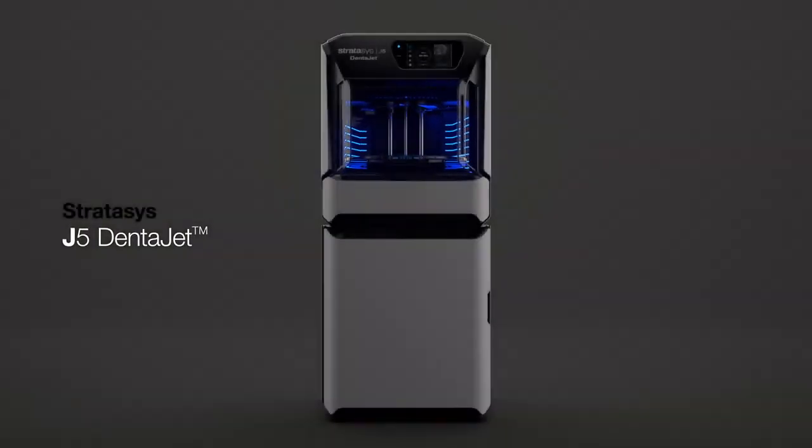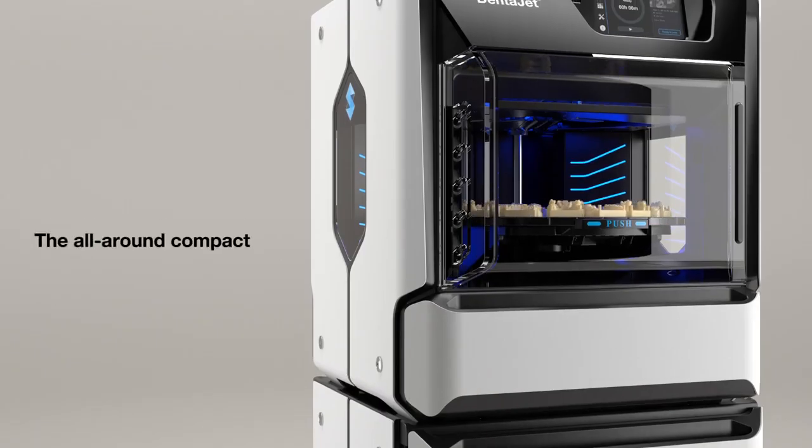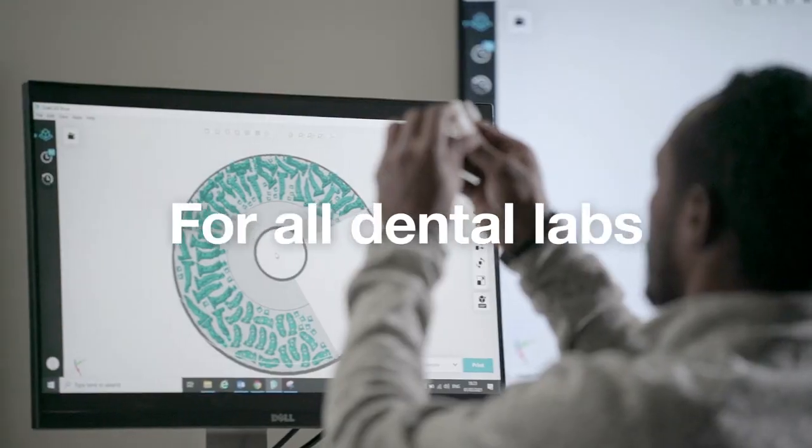Introducing the Stratasys J5 Dentajet, the all-around compact 3D powerhouse for all dental labs.